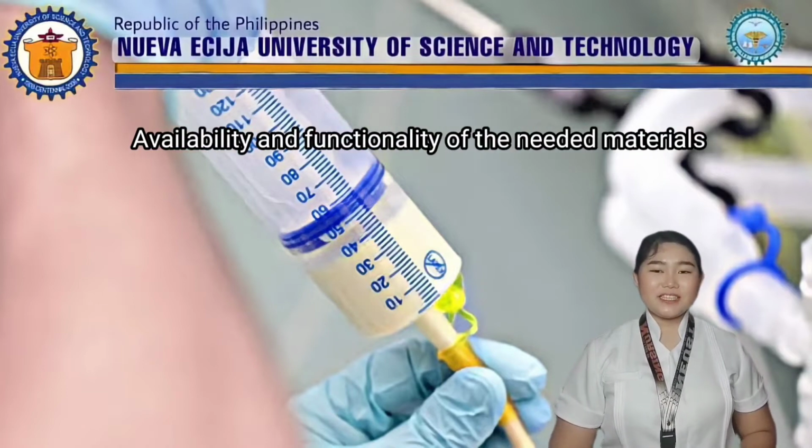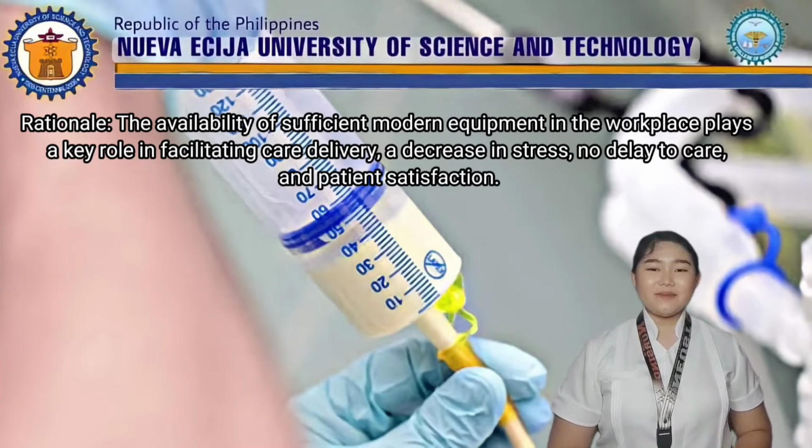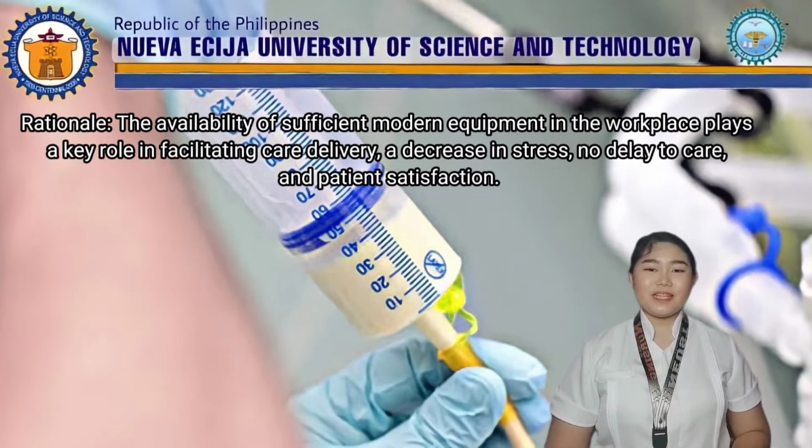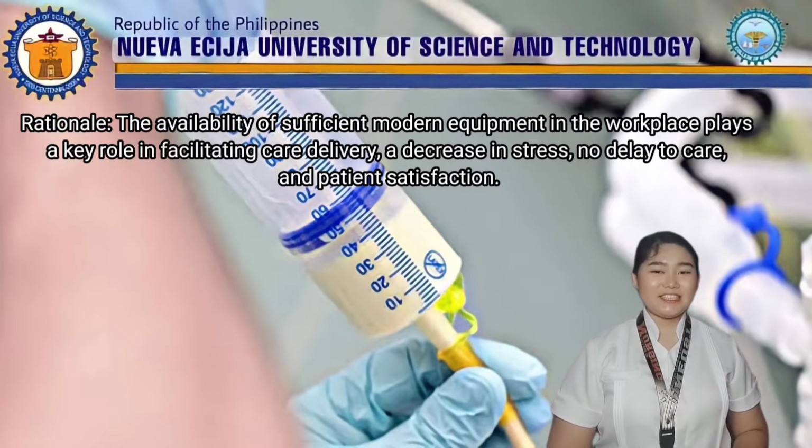Availability and functionality of the needed materials. Rationale, the availability of sufficient modern equipment in the workplace plays a key role in facilitating care delivery, a decrease in stress, no delay to care, and patient satisfaction.